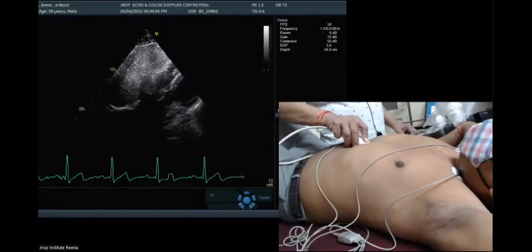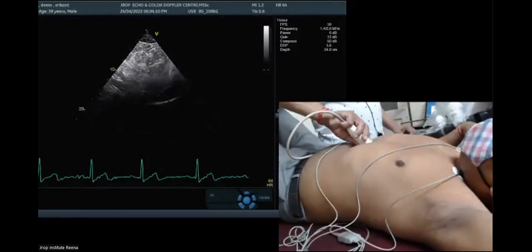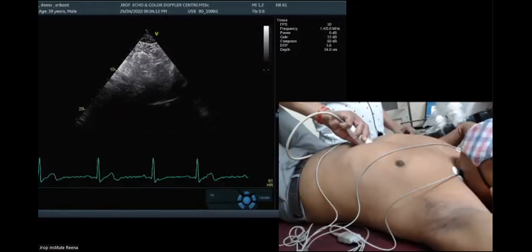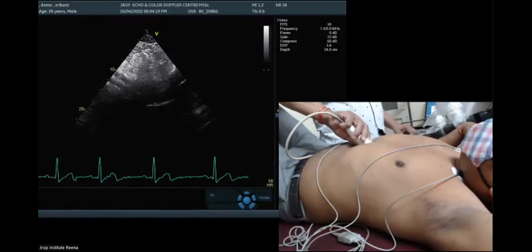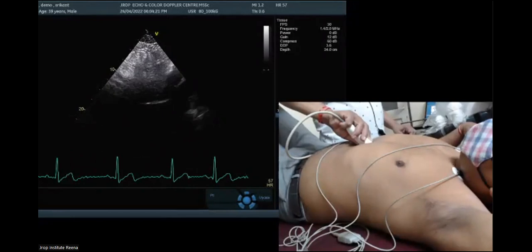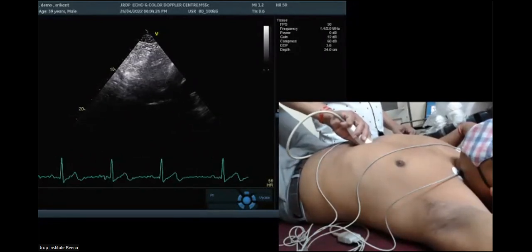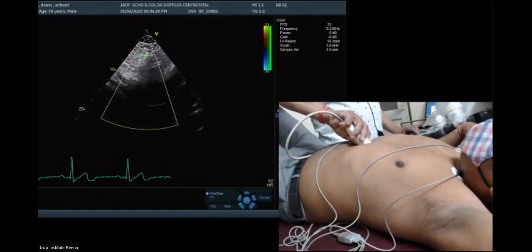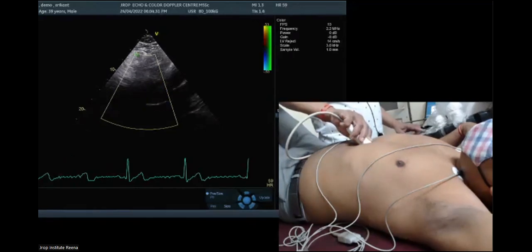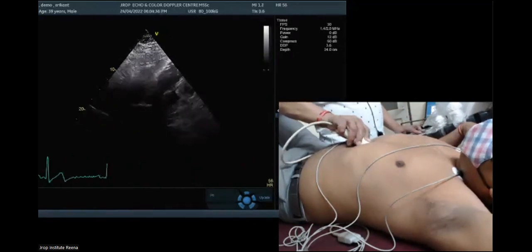Unfortunately, I'm not able to show him very categorically, but I'll try to show you images. First of all, aorta is posteriorly placed. Where is SVC and IVC? They are parallel to each other almost. SVC is on the left hand side, and aorta is on the left hand side, and IVC slightly towards right hand side. So the best part is I will not be able to demonstrate this, but I can tell you that one structure which is correlating with RA.